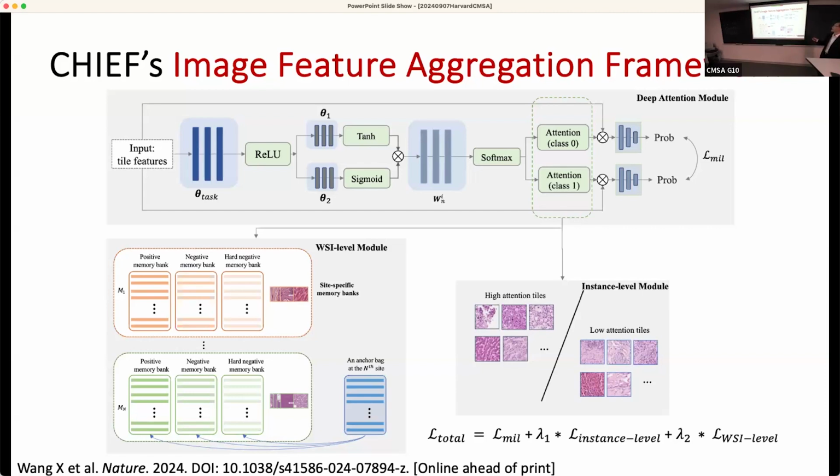And then at the end, we also extract the attention labels for evaluating these slides, and then we connect them with the original input information in another tensor multiplication. So this information highway right here is inspired by the residual neural network. It's essentially a skip connection to allow some of the image features we have identified using simple image encoders, based on a previously published pipeline called CTransPath, and we aggregate them with the features extracted by our additional layers of neural networks for further analysis.